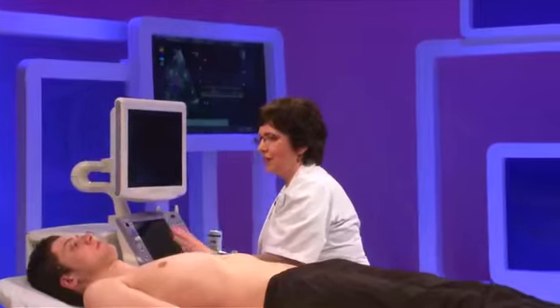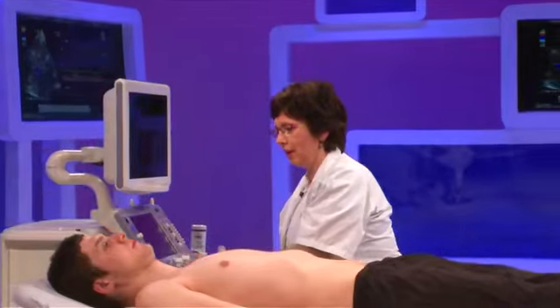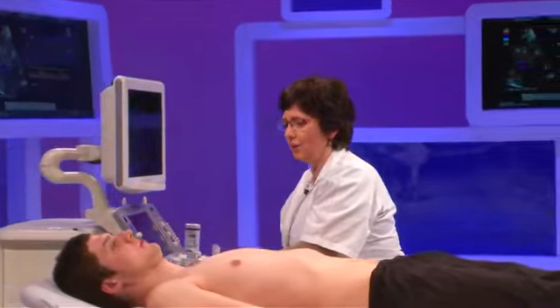So I just want to emphasize that for carotid examination, you must be very strict, and before concluding there's severe stenosis, you must check direct and indirect signs, and you won't make a diagnosis with one argument only. Key points of this examination are that we have to provide a systematic approach, to have a good alignment with the flow, and also not to rely on one single parameter to assess carotid stenosis. And finally, to look at direct signs, but also indirect signs at the level of the other arteries.